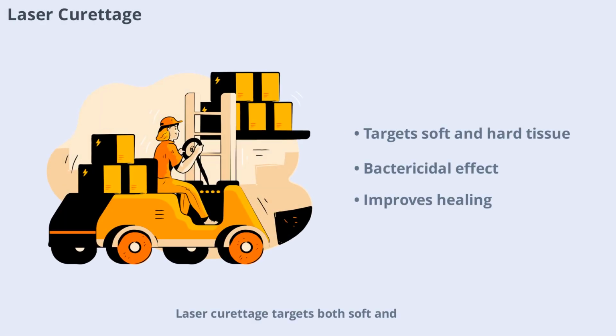Laser curettage targets both soft and hard tissues using focused light energy. The bactericidal and detoxification properties of lasers help remove the epithelial lining and improve healing, especially in moderate and inaccessible pockets. This advanced technique offers precise control and enhanced patient comfort, making it a valuable tool in modern periodontal therapy.